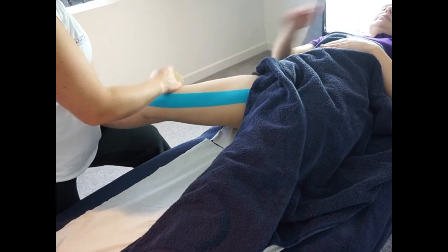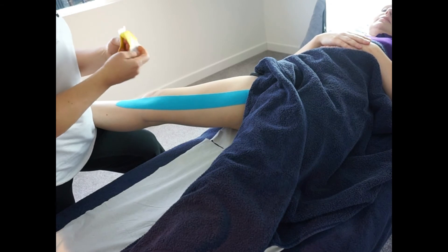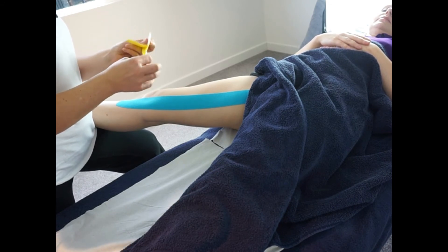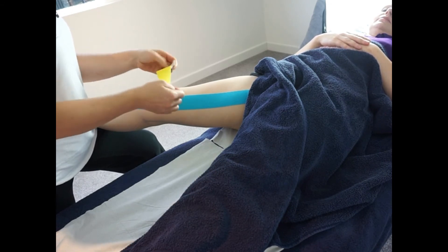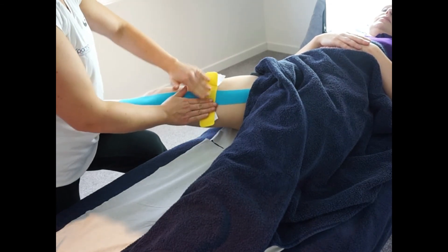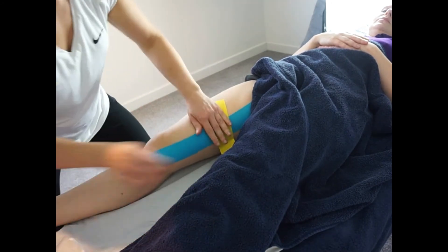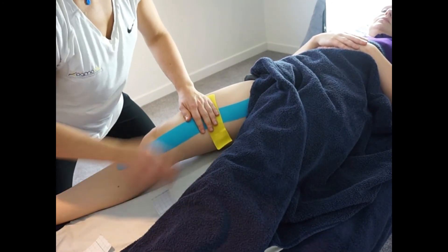Now get your client to show you where they feel pain. As you can see, it's on the adductor magnus, maybe towards the gracilis direction. Peel back the middle of the tape, apply a light amount of stretch, place the tissue on stretch, and lay the tape directly over the area of pain. Then simply anchor with no tension on the tape and no stretch on the tissue.